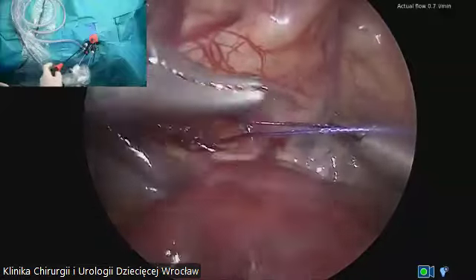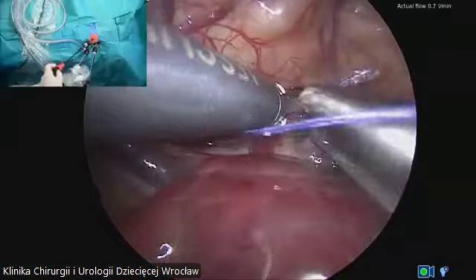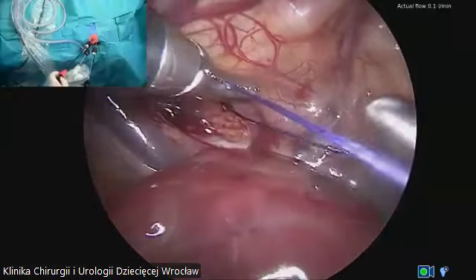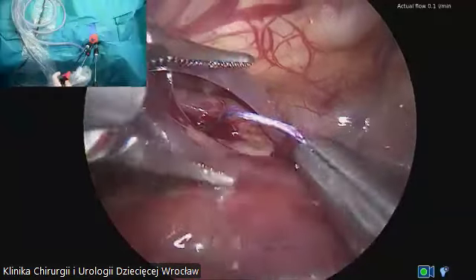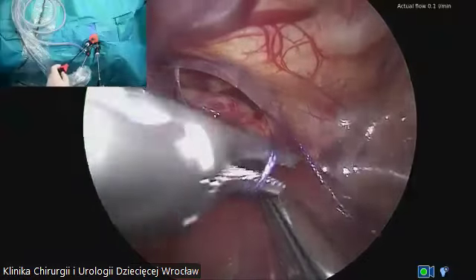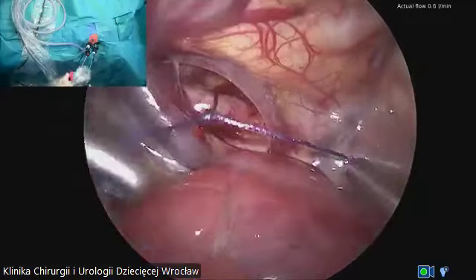Of course, we will do a sliding knot as usual. And you will see the advantage of a sliding knot when you ligate the fistula. That's very important to be at the level of the trachea. So with a sliding knot, it's much easier. I will show you the trick at the moment.